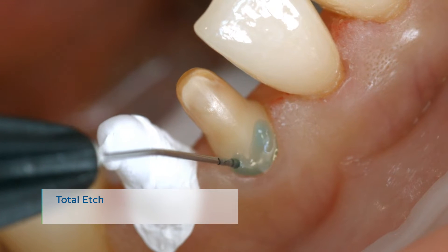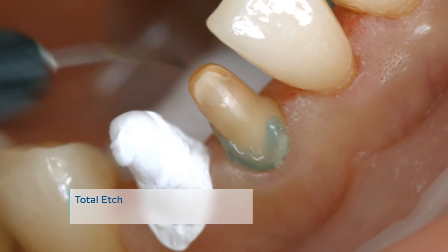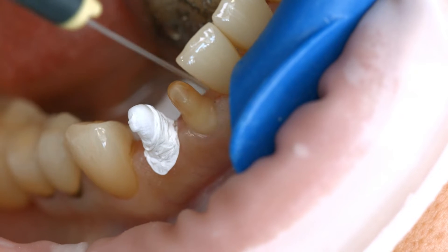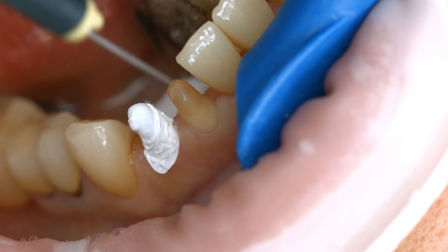Apply Phosphoric Acid Gel — for example, Total Etch — to the enamel and allow it to react for 15 to 30 seconds. Thoroughly rinse off the gel with a vigorous stream of water and air-dry the preparation until the enamel surfaces appear chalky white.